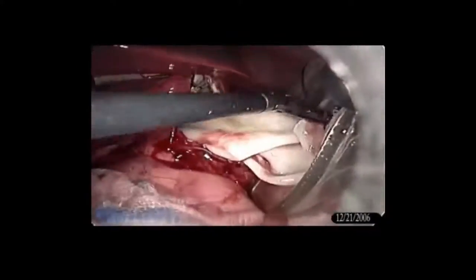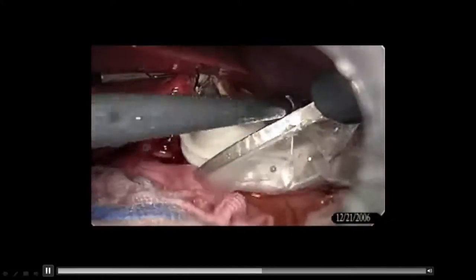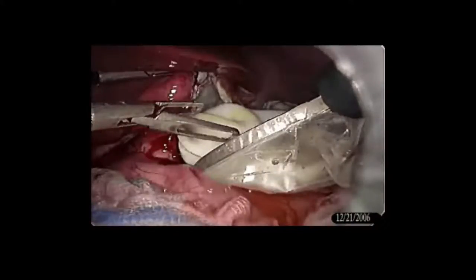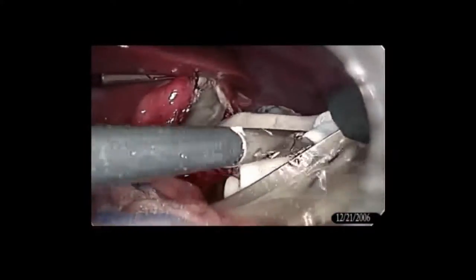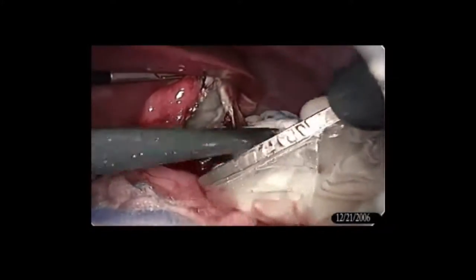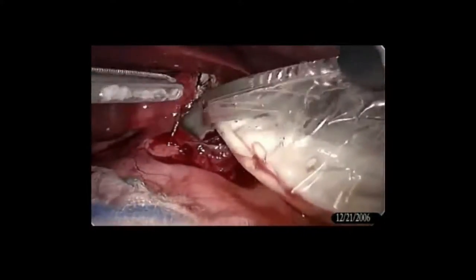Care should be taken that any spillage should be avoided. That's why there is a metallic ring on the endo bag. This metallic ring is very useful because it will self-retain there. Gloves cannot be held like that, because with gloves one or two instruments will be required for holding, but it is self-retaining. Then you can transfer all the germinal layer. After that you can close the endo bag and slowly pull it out. Then again, you have to use suction irrigation, and ideally a 10 mm suction should be used.